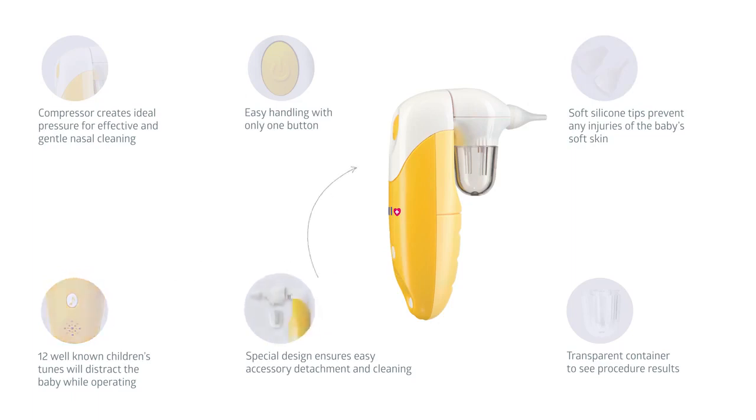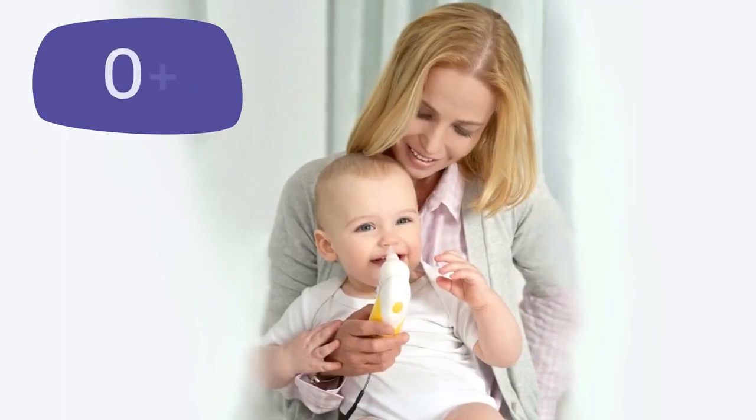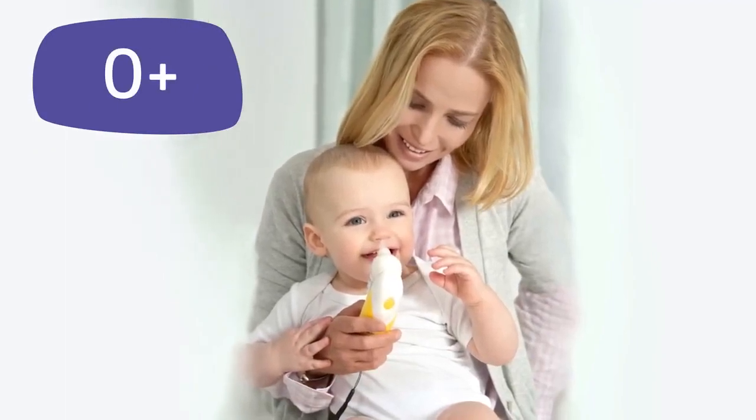Its special design makes it easy to disassemble and wash the device. The transparent container allows you to see the result of the procedure. The BeWell Nasal Aspirator is suitable for children from birth.